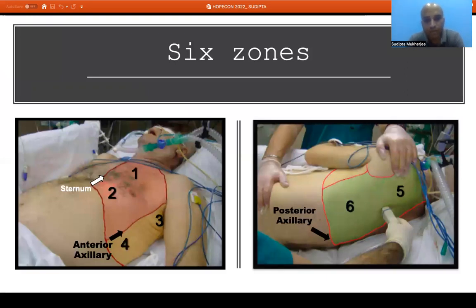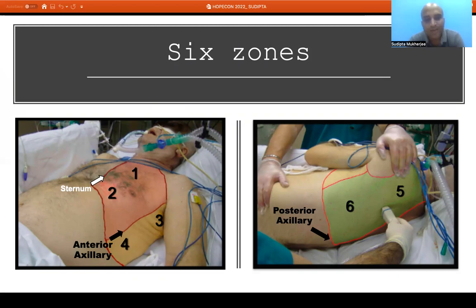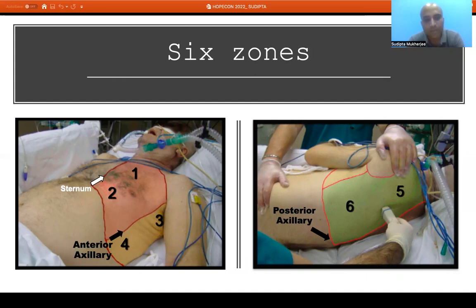For lung ultrasound, we conventionally divide the lung into 6 zones per side — zones 1 through 6 — giving 12 zones total. The anatomical landmarks are: medially the sternal border, then the anterior axillary line, and then the posterior axillary line. A horizontal line passes through the fifth intercostal space just below the nipple, dividing the lung into upper and lower zones on each side.